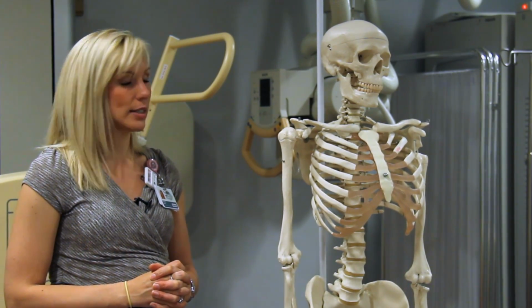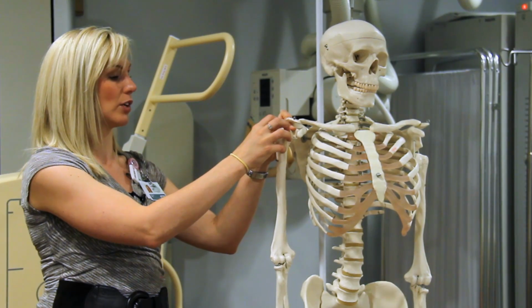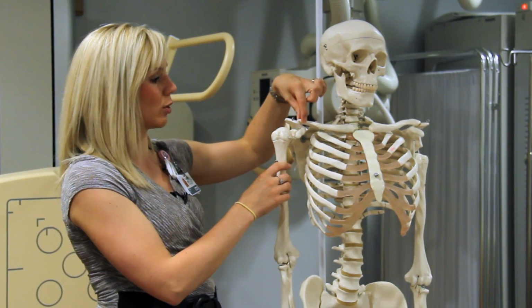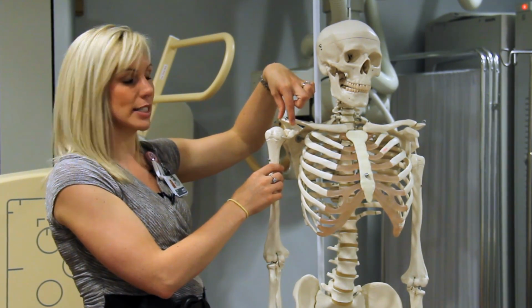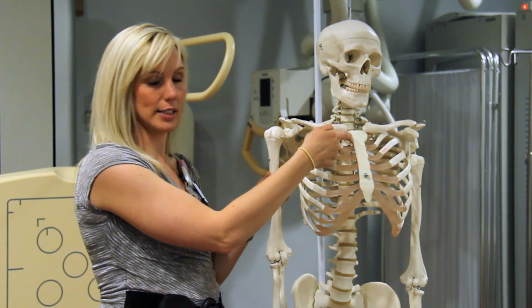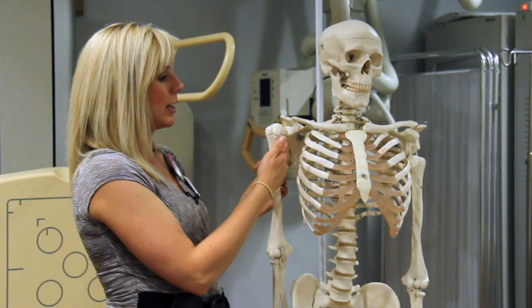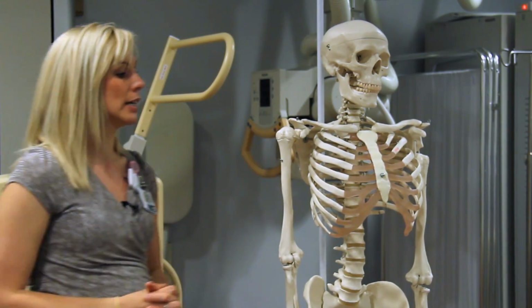The three joints in the shoulder: glenohumeral, created by the head of the humerus and the glenoid fossa of the scapula. The AC, the acromioclavicular joint: the acromial end of the clavicle and the acromion of the scapula. And then the third joint is the sternoclavicular, the SC joint on the far end. So three joints that have to be included in your AP shoulder imaging to get a full shoulder image.